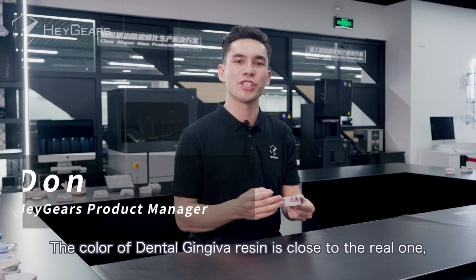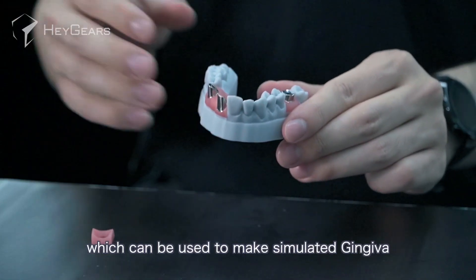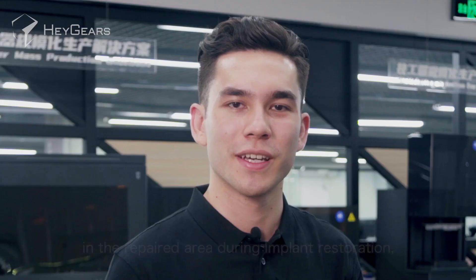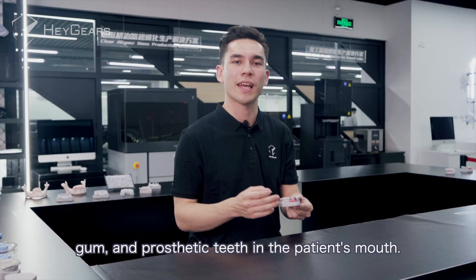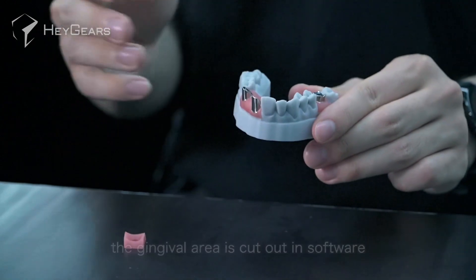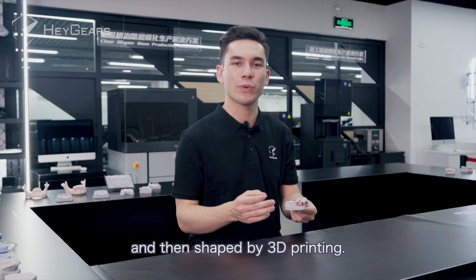The color of the dental gingiva resin is close to the real one, which can be used to make simulated gingiva in the repaired area during implant restoration to better replace the relative position between the abutment, gum, and prosthetic teeth in the patient's mouth. To make a digital model, the gingiva area is cut out in software and then shaped by 3D printing.